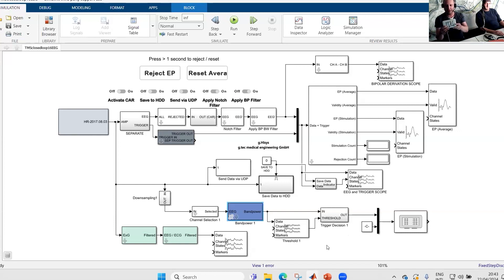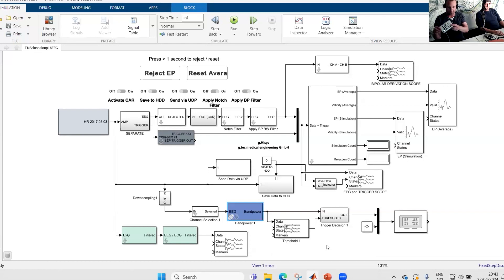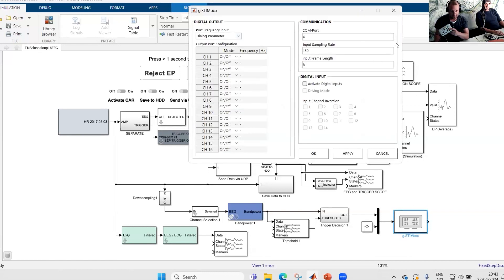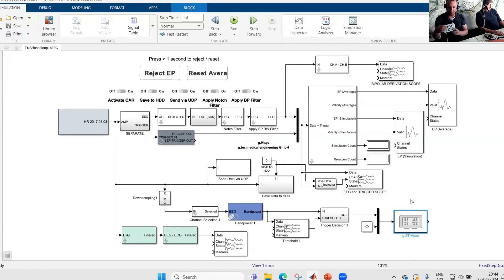This is the G-Stim box. We have outputs and inputs on this side. With the outputs, you can trigger external devices. The device is connected with a USB connection to our computer. We can also use it to connect other stimulation devices, for example for SSVEP experiments. It's a box we develop that we can interface through our Simulink interface. When I double-click the Stim box, we just have to check that the correct COM port is used. From here, we have a cable connected to output 1, which is then connected to our TMS device.